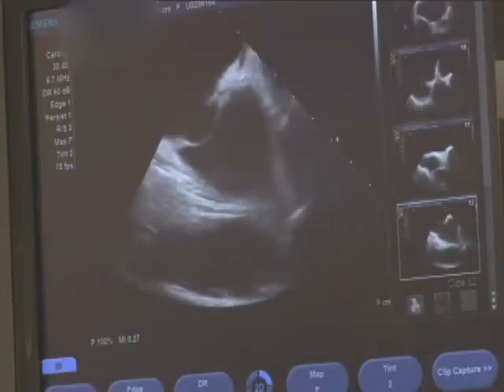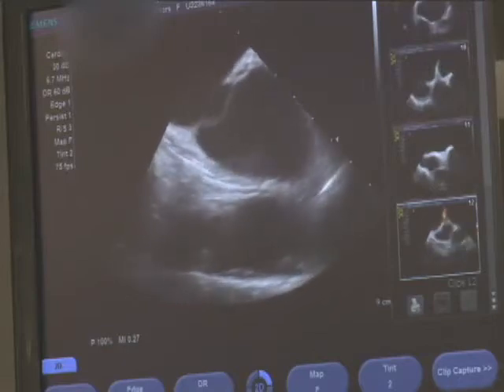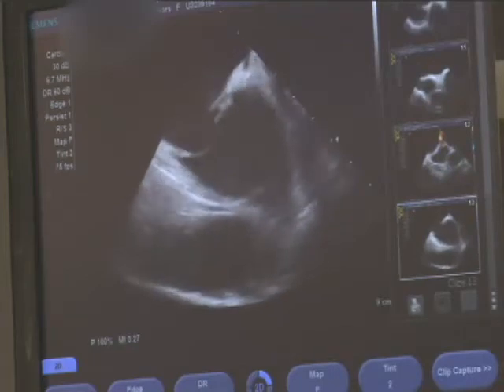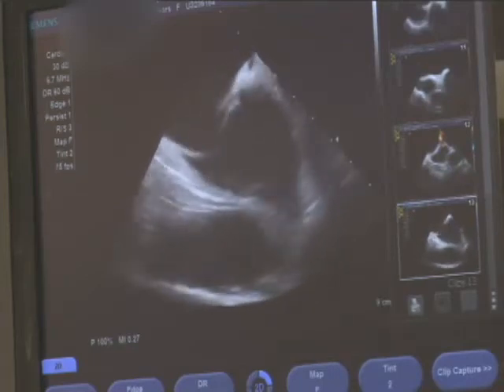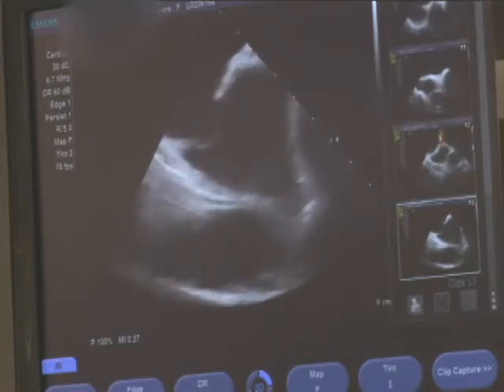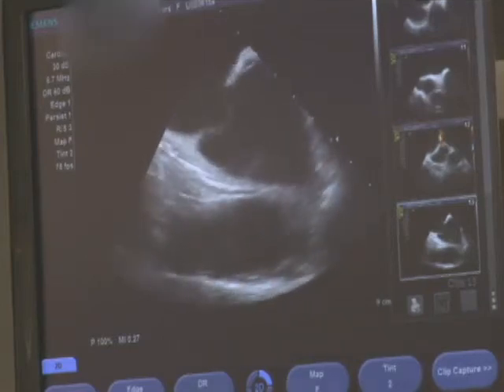The atrial septum can be better visualized with slight posterior deflection and clockwise rotation of the probe. Frequently, the descending aorta may be seen beneath the left atrium in this view, with an esophageal stripe visible between the descending aorta and the left atrium.